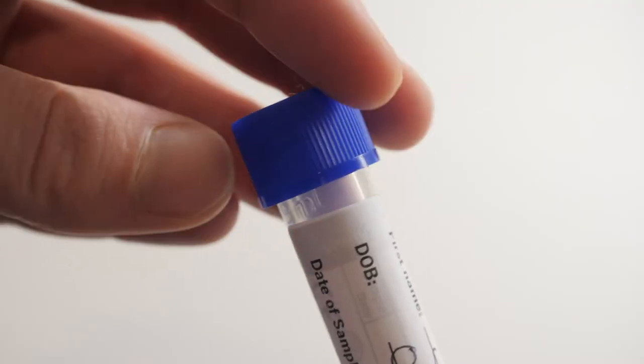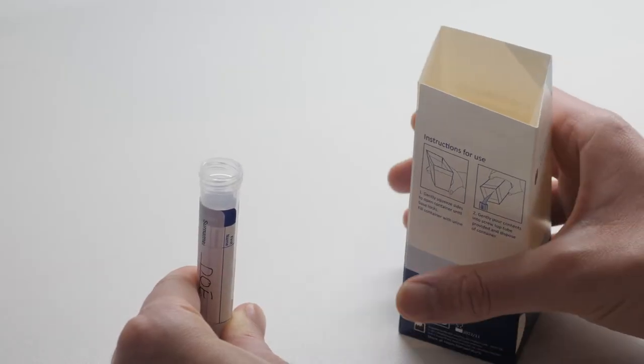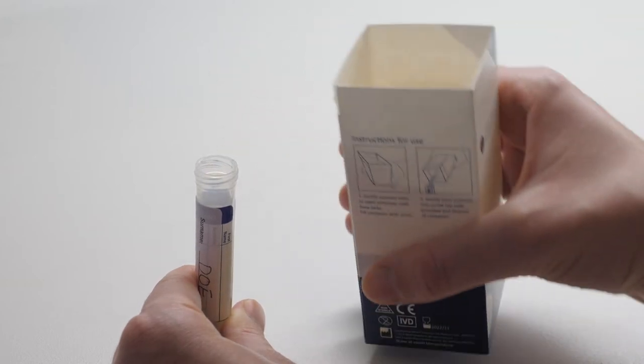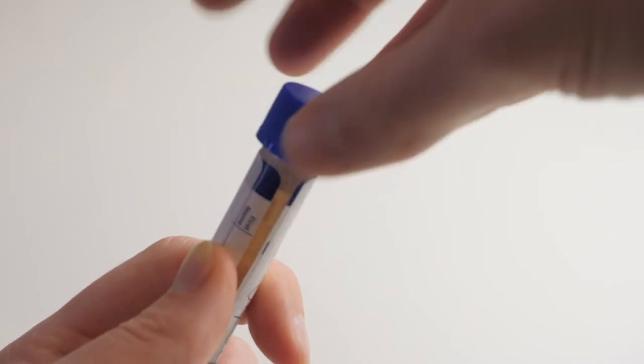Unscrew the lid of the sample tube and carefully fill the urine sample tube from the urine collection box, taking care not to get liquid on the outer of the sample bottle. Screw the lid of the sample tube tightly.